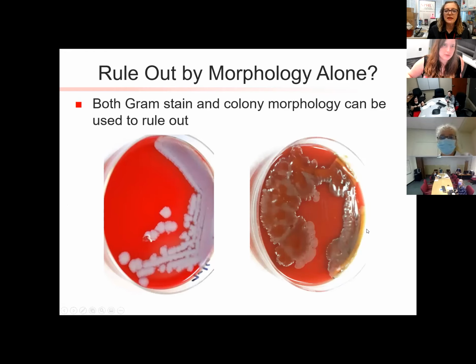On occasion, everybody has a type of organism, which is probably Bacillus, that looks really mucoidy. And I bet you've seen this before. It's usually a great contaminant, and it's just the ugliest thing in the world. It looks so slimy. But don't be concerned. This type of organism that spreads through a whole plate, well, Bacillus anthracis will spread through the whole plate too, but for it to look that mucoidy, you can rule it out. Your organism should stay very nicely ground glass looking.